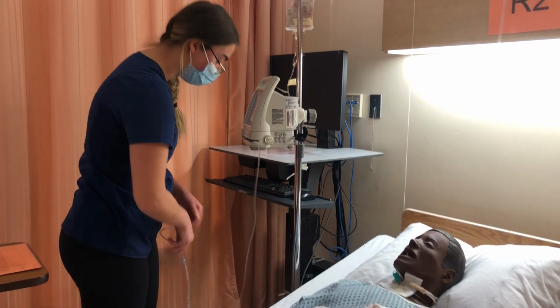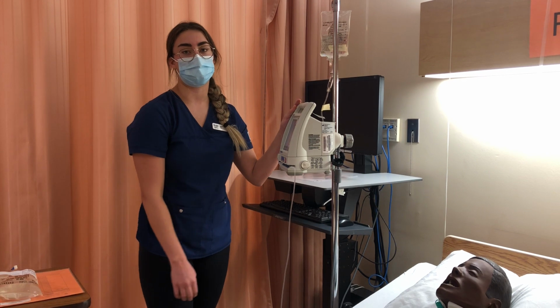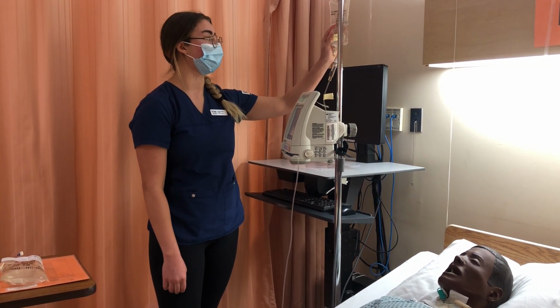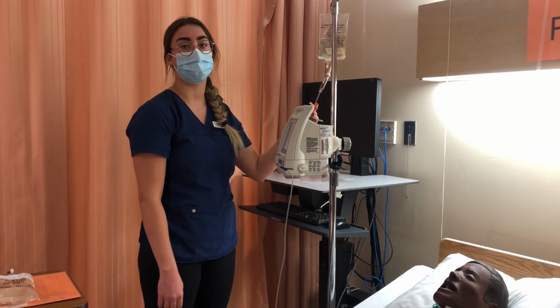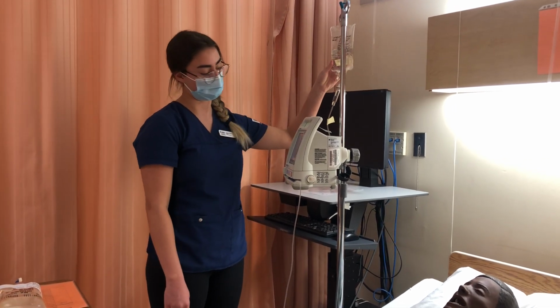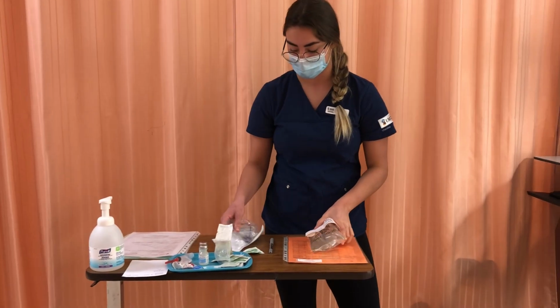All my clamps are open down the line, and I can see that my pump is running the correct rate that the doctor prescribed, and they're also running the correct fluid of normal saline. I can see that the tubing is not expired, so I can use this tubing, and that this is compatible with my patient's medication. Okay, so I'm ready to hook up my secondary bag.